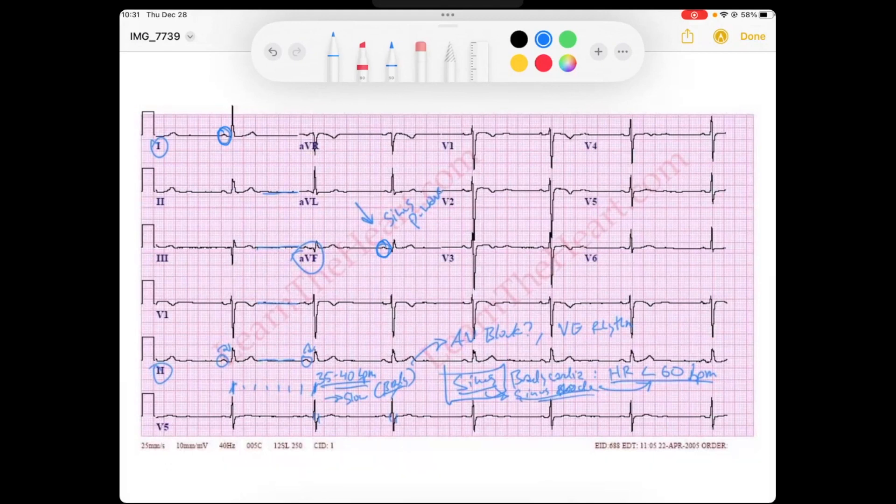So, this is a great example of a sinus bradycardia. All right, we've excluded other causes of bradycardia, and we've verified that this P wave that is driving our rhythm is from the sinus node.